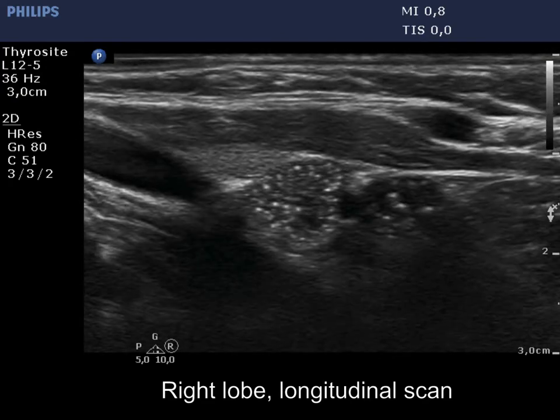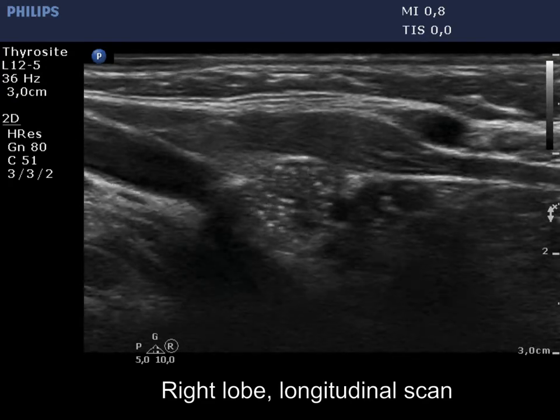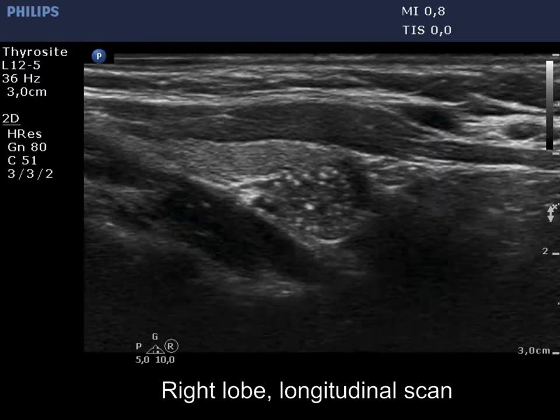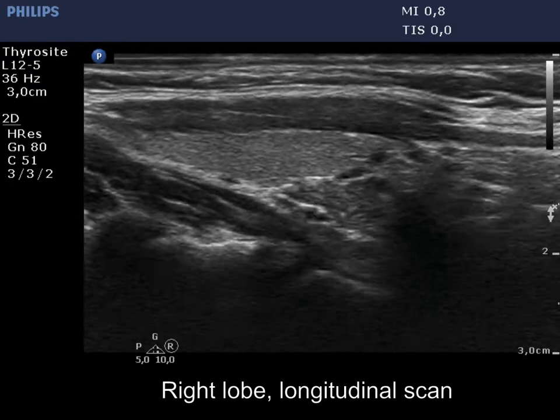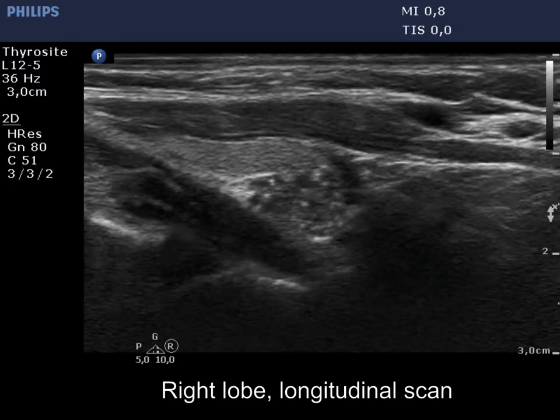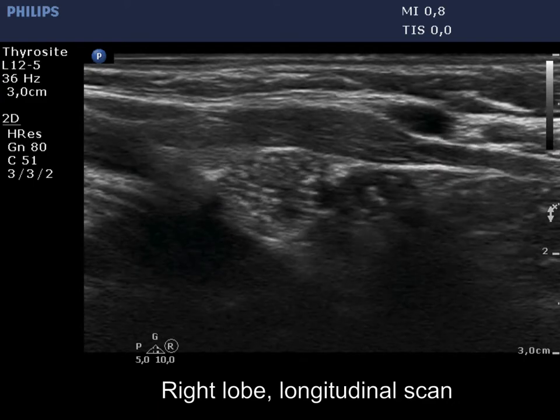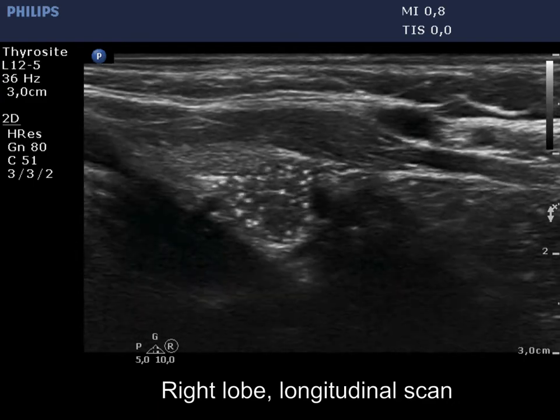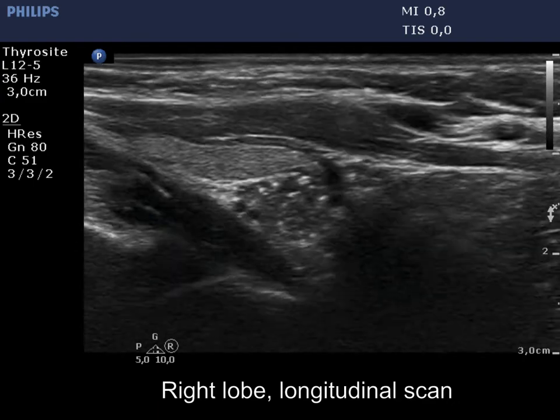Longitudinal scan reveals that there are three lesions; the lower pole of the lowest one cannot be identified. This is the starry sky phenomenon, a frequent finding in the thymus.